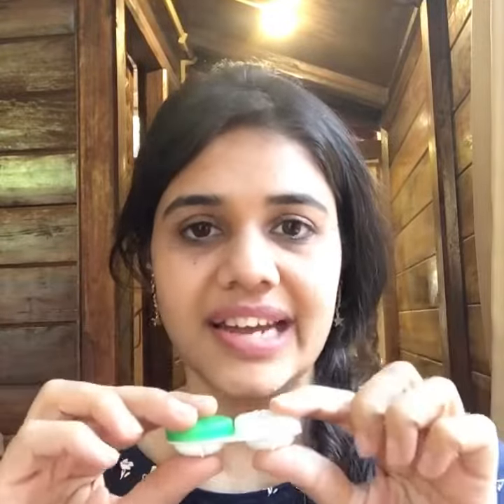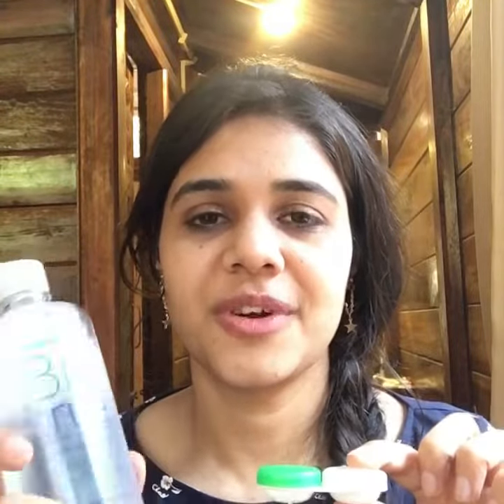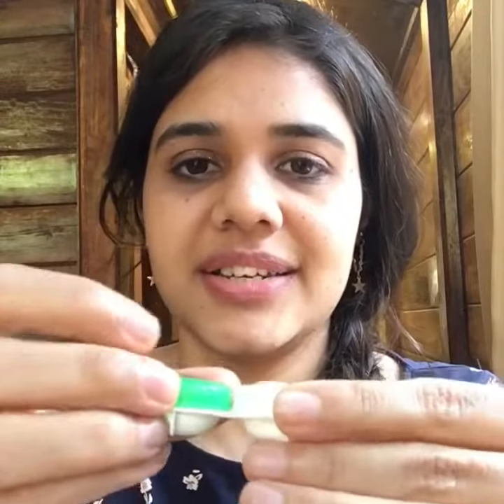Usually once you buy a lens and unseal it, you need to keep your lenses in this kit under the solution. The solution I am using is Bio True. I have been using this solution from the day I bought my first lenses, so I really found it useful.